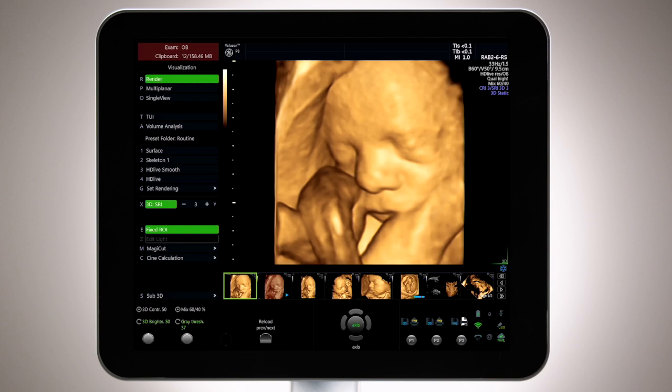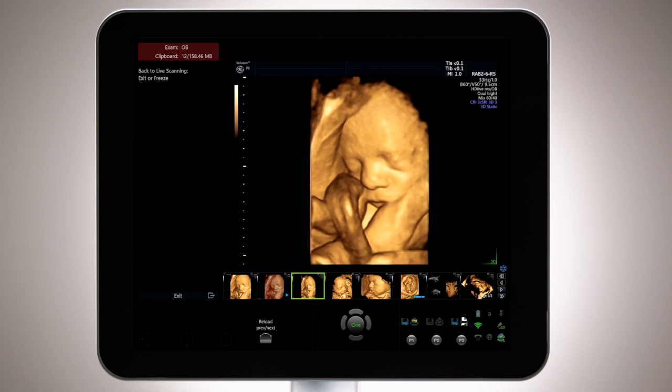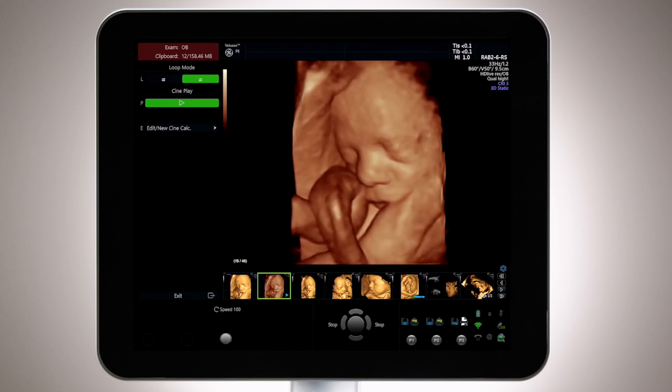Included in the 3D customization choices are Single Volume, Static plus Calc Cine, and Screenshot. Single Volume will allow a volume to be recalled at a later time for manipulation utilizing Voluson raw data. Screenshot saves only a bitmap of an image, so the file size is reduced for storage, but there are no raw data capabilities. Static plus Calc Cine allows for any 3D rotations to be stored as a clip.